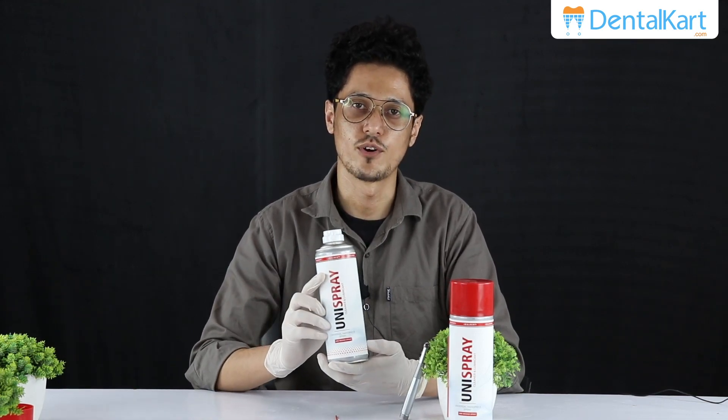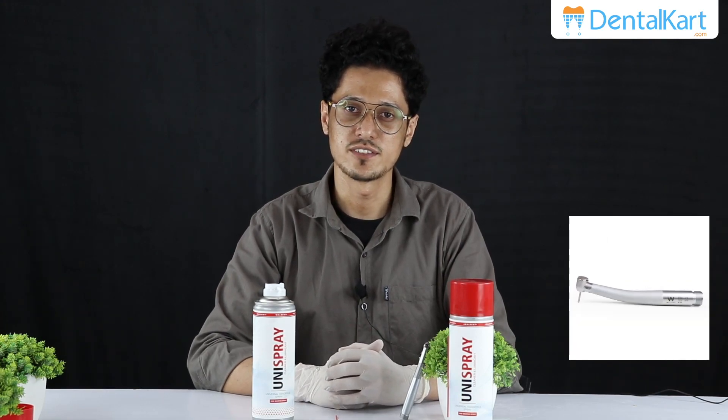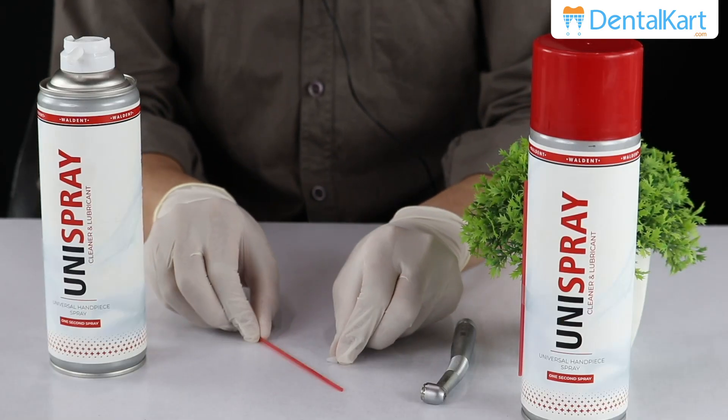This is a Uni spray from Walden. It can be used for lubrication of high-speed dental turbines, low-speed handpieces, air motor heads, and contra angle heads. We have two attachment options which can be applied to the nozzle of the spray can.